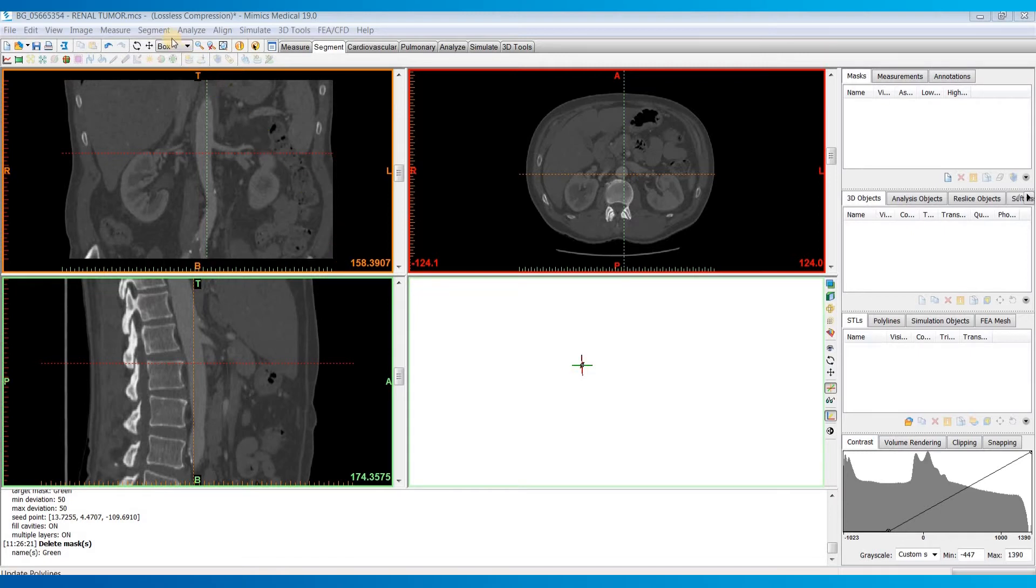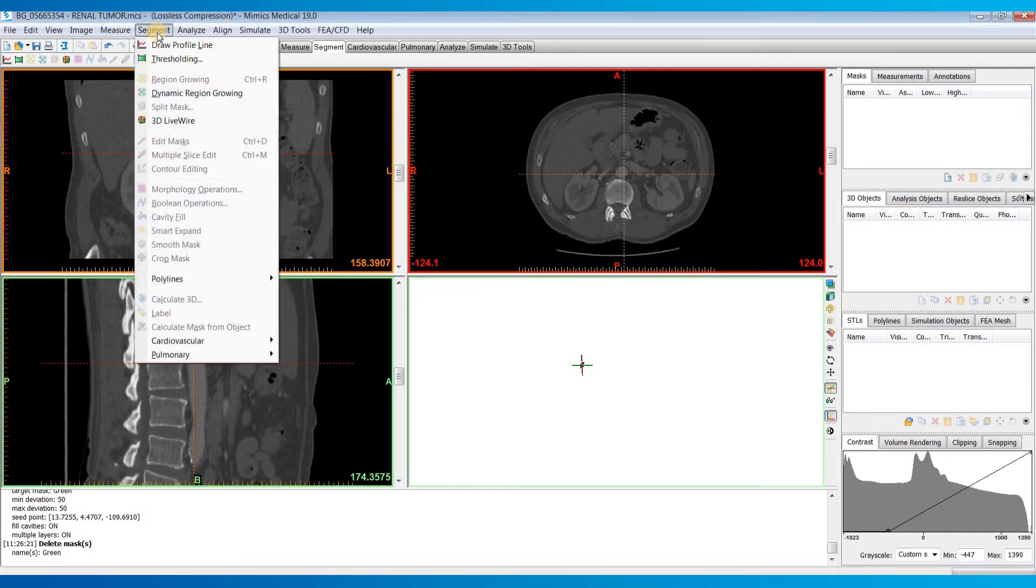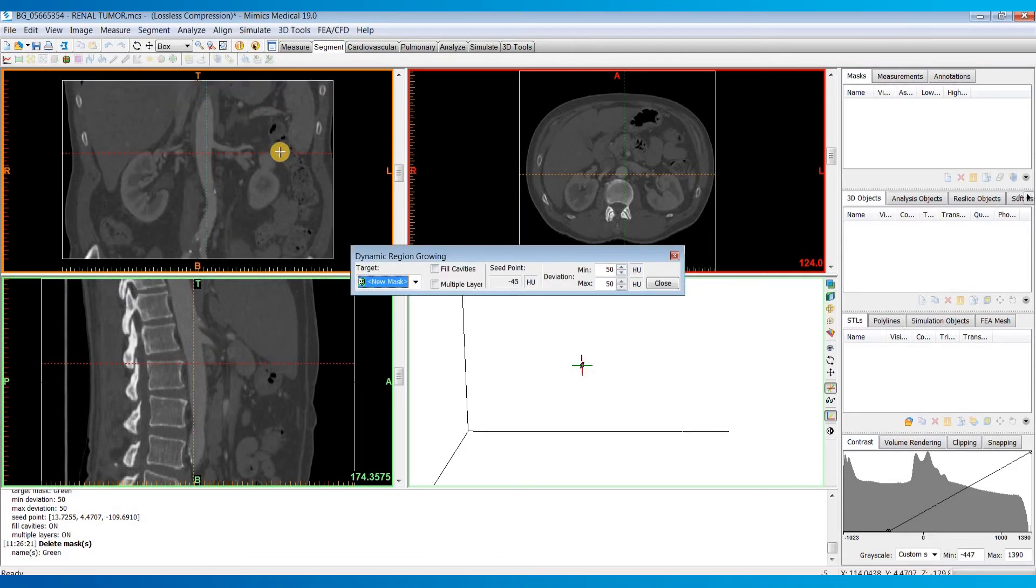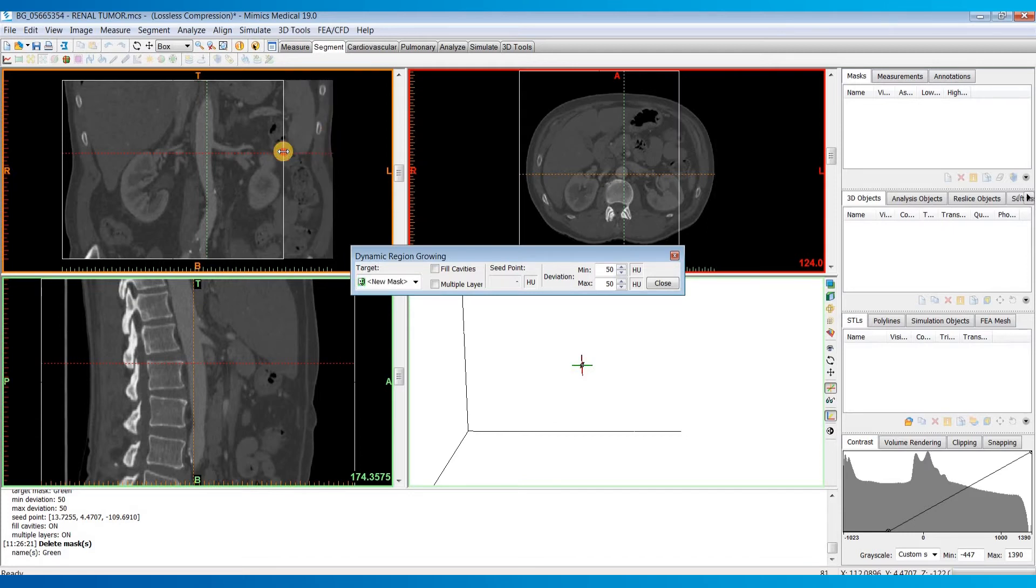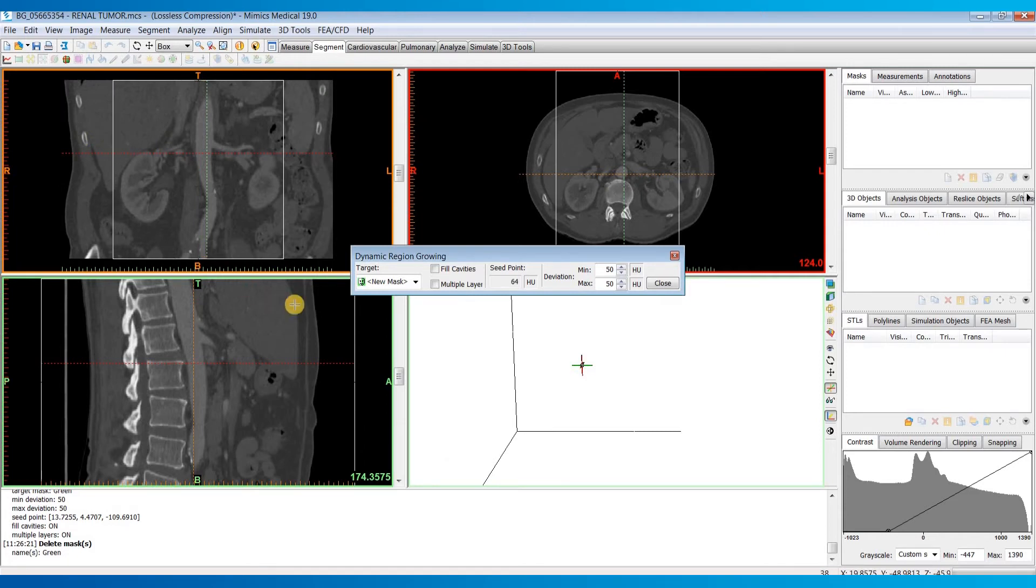So let's open up the segment menu and choose the fourth one down, Dynamic Region Growing. And so one of the first things I'd recommend you do is to drag this white box to just crop it down to the region you're interested in.